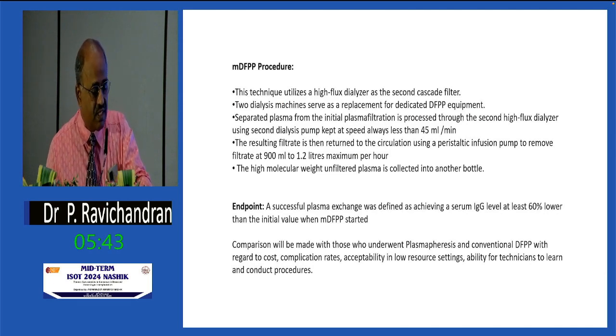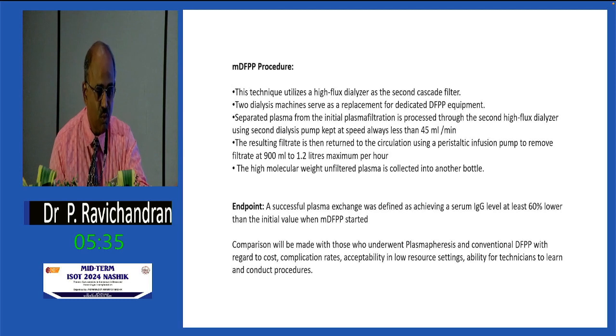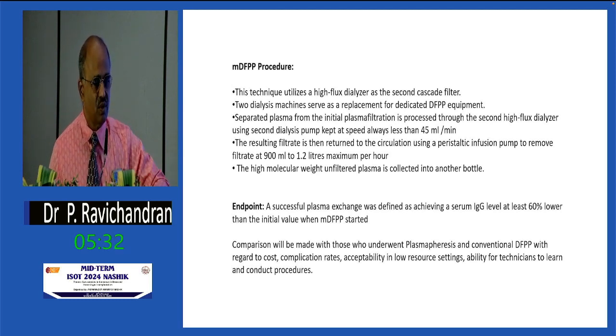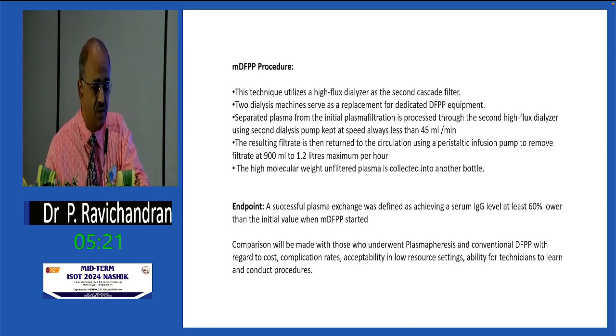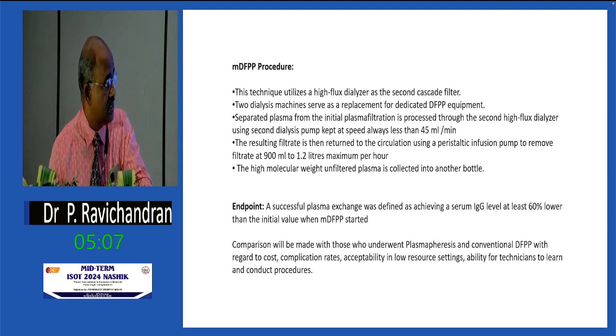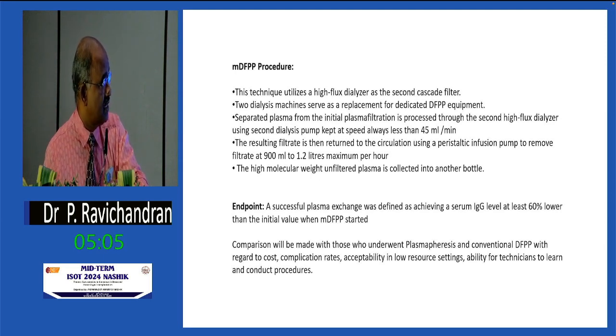So in the modified procedure here, what we did was for the second filter, instead of using the routine filters, we were using dialyzers or high flux dialysis filters, which are more frequently available now, where we could reabsorb most of the filtrate and give it back to the patient so that we can cut down the cost of replacement fluid. Two dialysis machines we could use, or a separate blood pump as a dedicated DFPP equipment. And separated plasma is run through the second filter, and then a third peristaltic pump returns the effluent into the patient circulation.